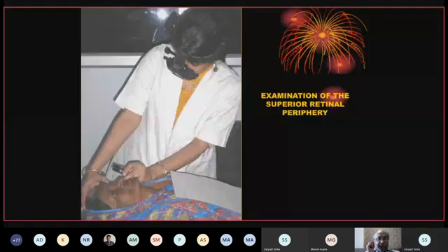Yes. I think these last two slides are extremely important, and the word that you used, Bharatanatyam answer, I think is very, very important. You have to be able to move your hip, your neck has to be able to bend, and it's an exercise by itself. Holding the patient's head down.